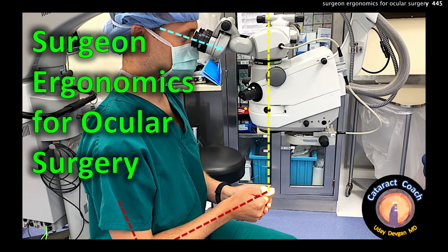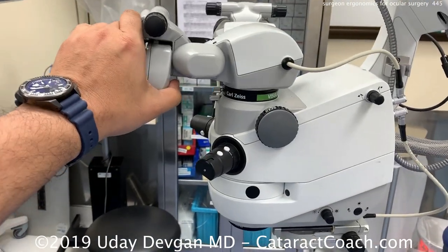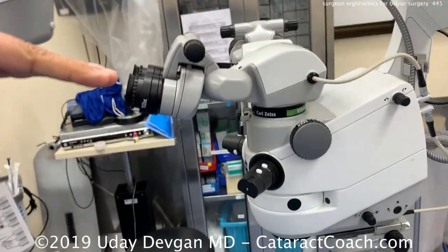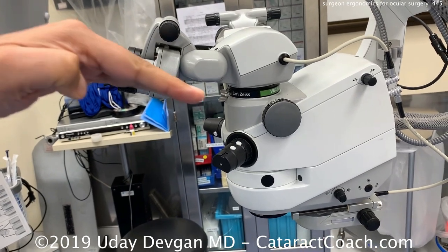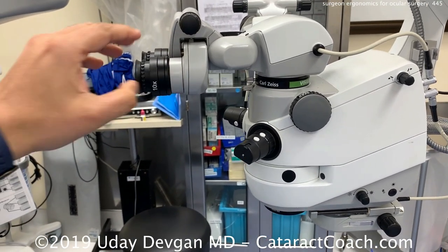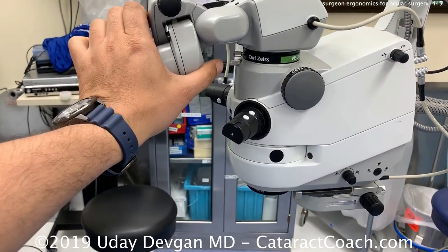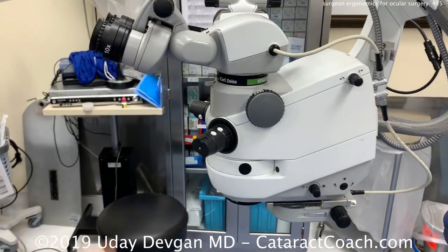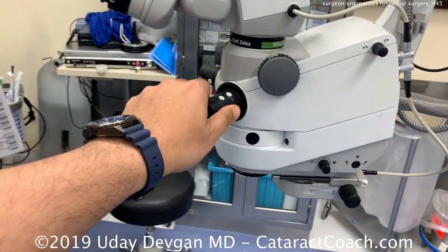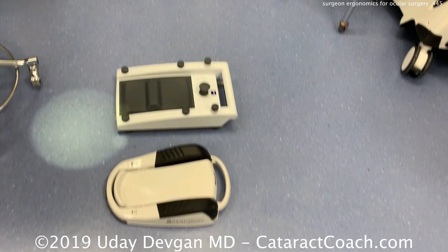cataractcoach.com — surgeon ergonomics for ocular surgery. This is a surprisingly important topic. Let's look at the microscope oculars first. I prefer a slight downward gaze — that's the most comfortable for me. Some people like it parallel to the floor. The one I don't like at all is looking up; I think that strains your eyes, your neck, your head. It's not a good position. So decide what angle you like.